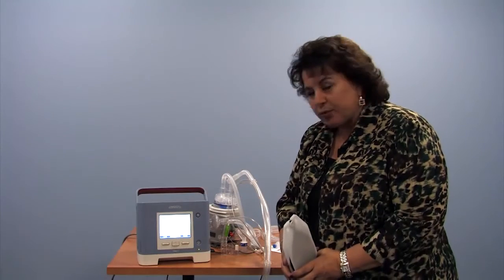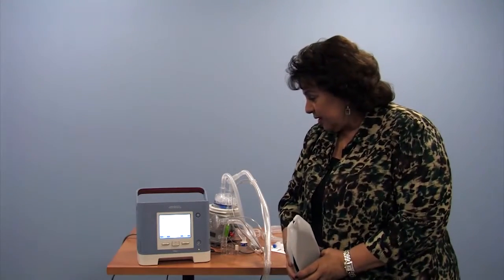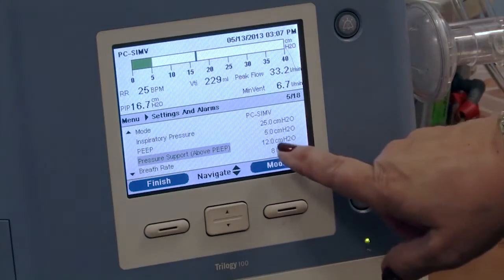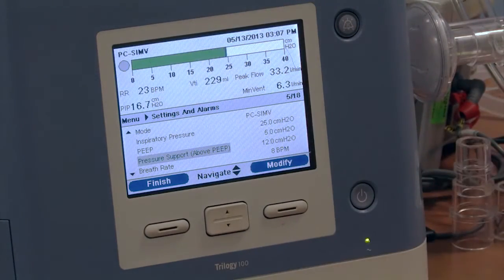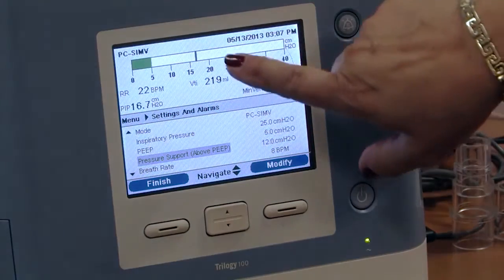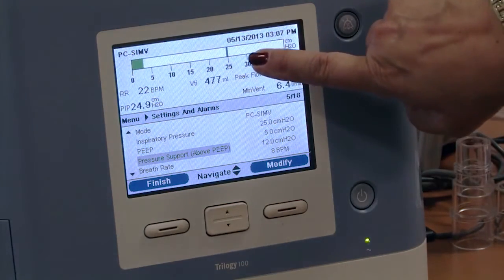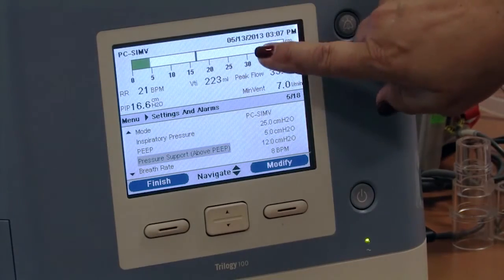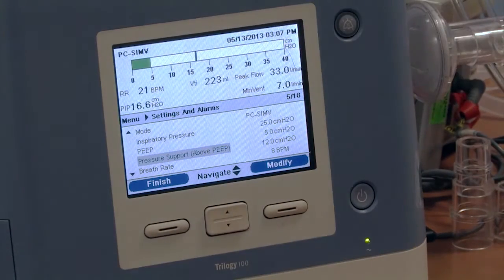In between those 8 breaths, this patient can use the pressure support breaths, which we talked about are 12 centimeters above 5. 12 plus 5 equals 17, so we'll see the number go to 17, 17.5. And when it's time for an intermittent mandatory breath of the 25 over 5, the peak inhale pressure 25, the PEEP 5, we see the manometer here go up to 25 of pressure.